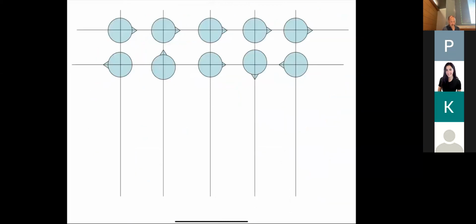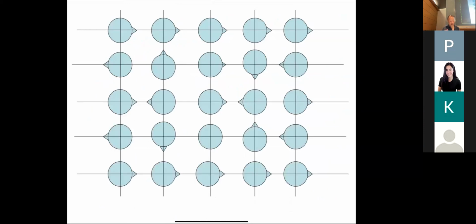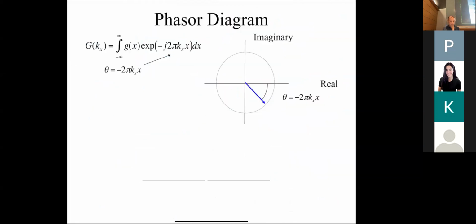Okay, so this is just showing you sort of a plan view of the same thing, showing how basically we get different phases because the different spins over a certain amount of time change different phases. Those phases now give us information about the spatial variation.